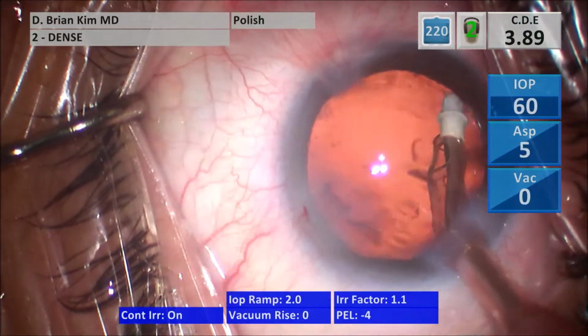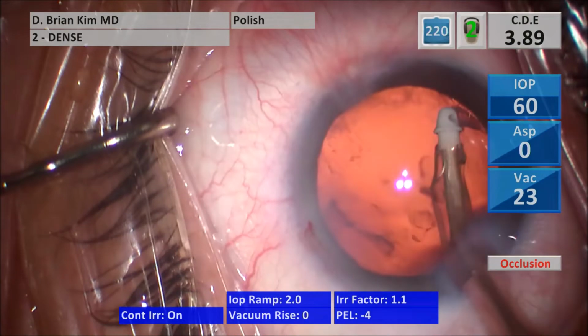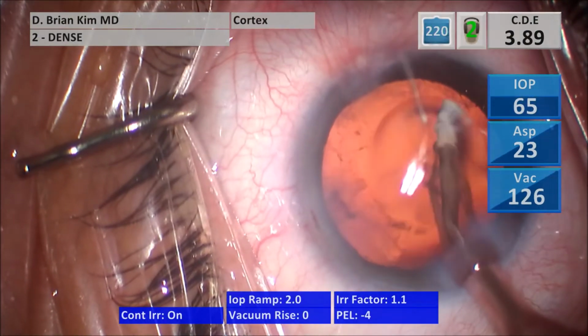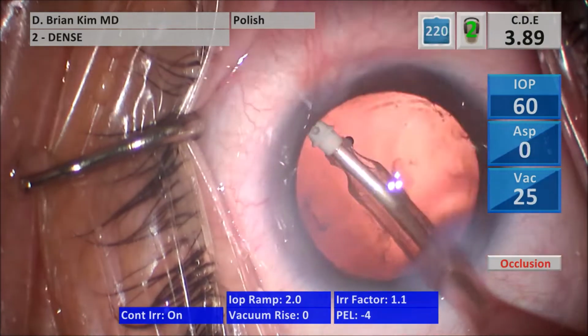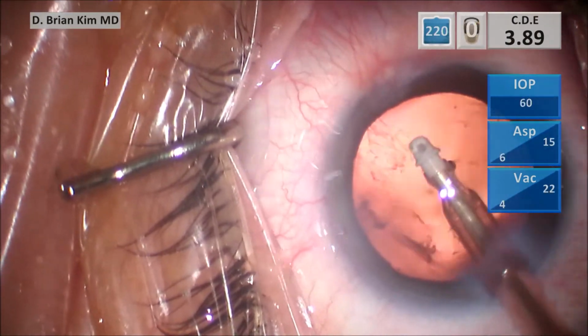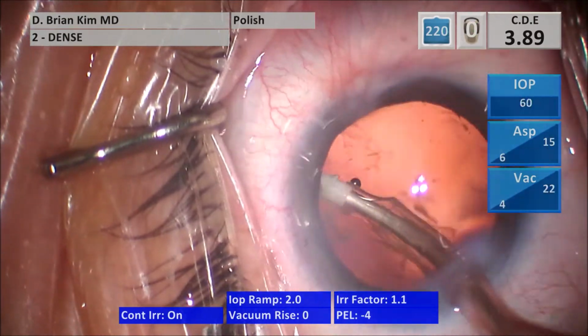And I switch to polish mode, polishing underneath the rhexis edge. And then you'll grab some cortical material along the way. You switch to cortex mode and then back to polish mode. Again, I'm polishing the lens epithelial cells, but also some stray fragments of cortex.